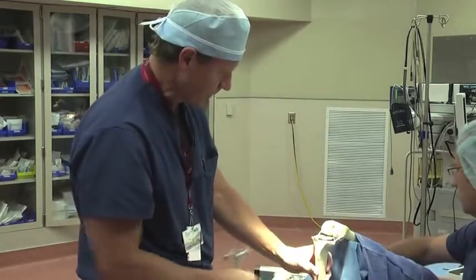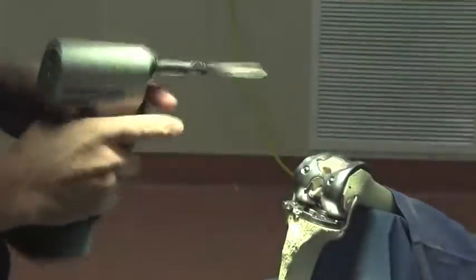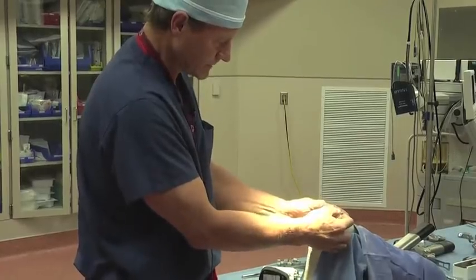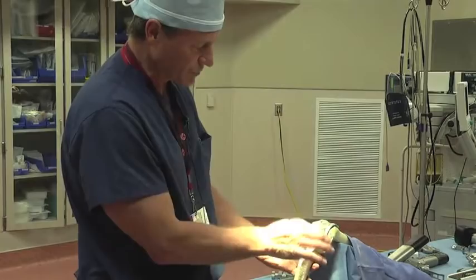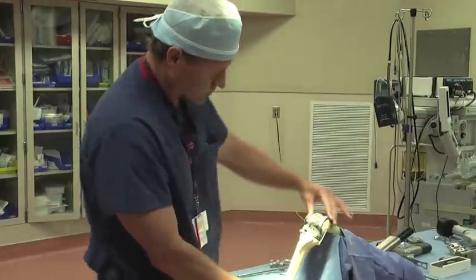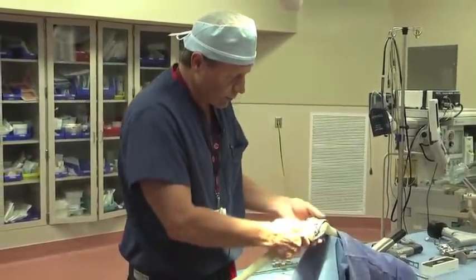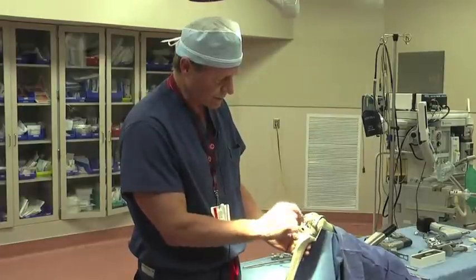We'll go back and turn our attention to the femur now. To finish the groove for where the patella will rotate in the implant, we'll make a little cut along here. To finish this so we can trial it, we'll go ahead and put this plastic piece on for the trial. Now the femur is completely prepared, and we have to determine what the size of our polyethylene component — the piece that fits between the two metal components — will be. We'll snap this into place and then we have our trial implant on. We'll drop the kneecap back into place, take our retractors out, and put this knee through a range of motion — making sure we can get it fully straight and fully bent. We want to check the stability of the knee, making sure it's all stable and within the constraints of the ligament. We have the ability to pop this component out and go with the thicker piece.